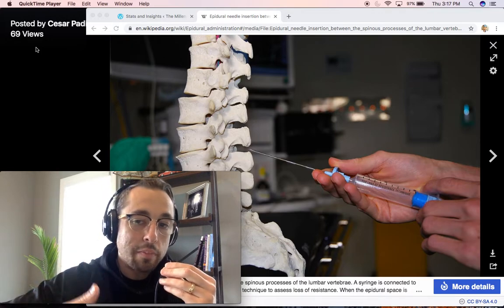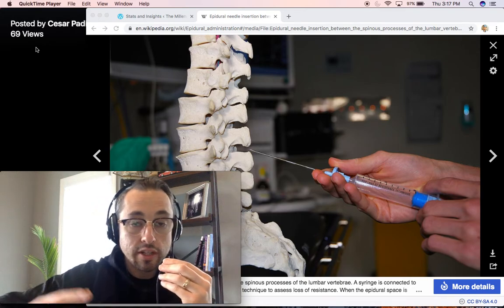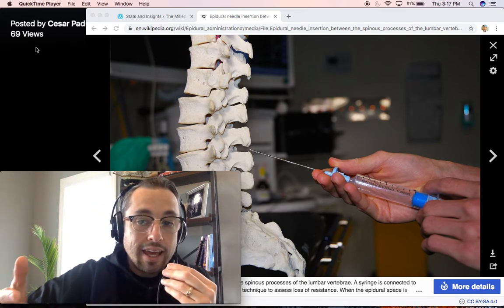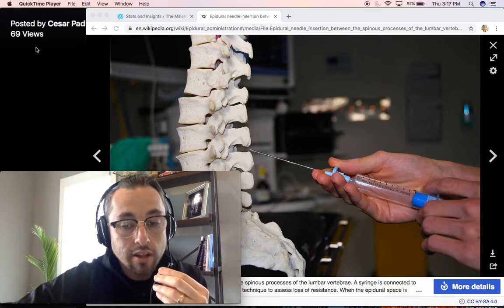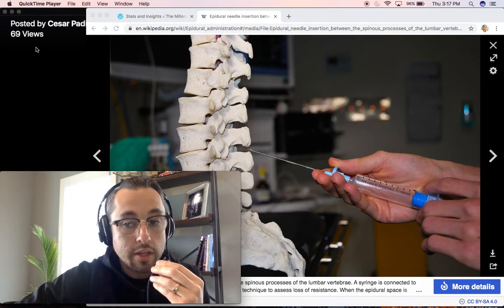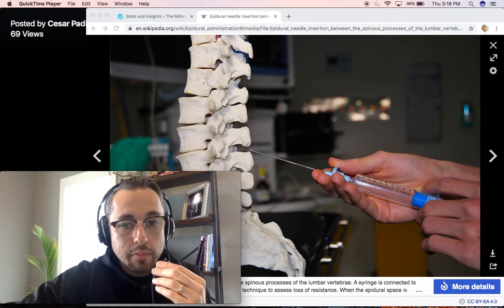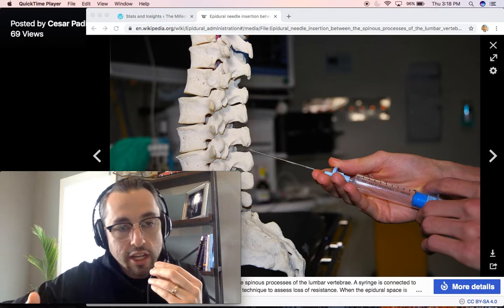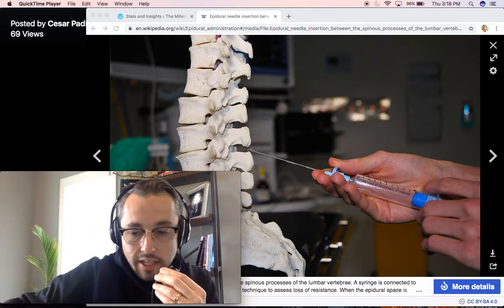The epidural is a procedure that's commonly performed, especially in labor and delivery. It's the way that we deliver the most common anesthetic on labor and delivery, in terms of anesthesia. And there's also a lot of mystery behind it. There's just not a lot of good educational videos showing exactly what the procedure actually is.